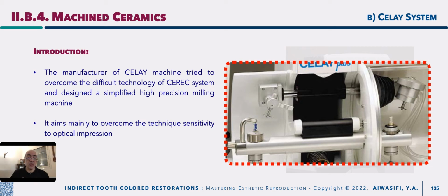That's why you don't have any digital components that help you in design or correction or manufacture. At the same time you are tracing a part or a surface or an area of your pro inlay, at the same moment it will be carved or ground from the block on the other side by the help of a diamond cutting tool.